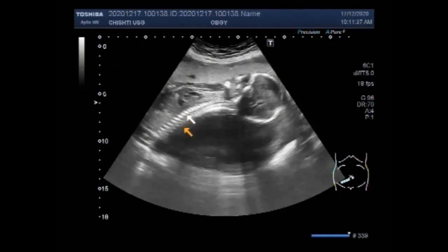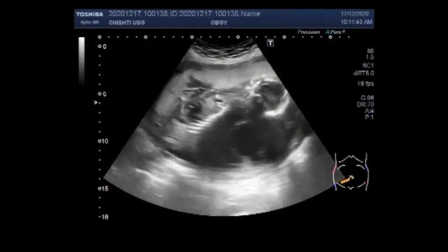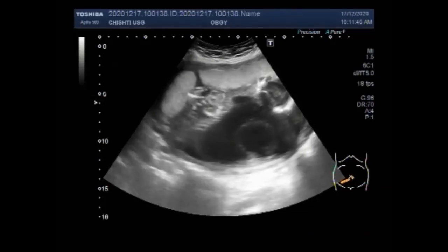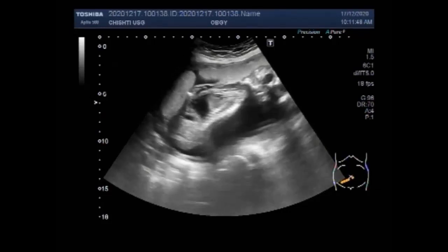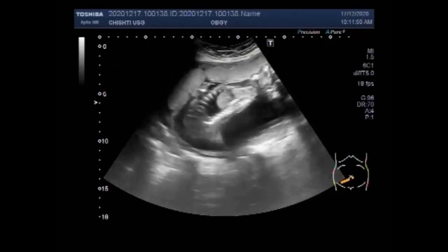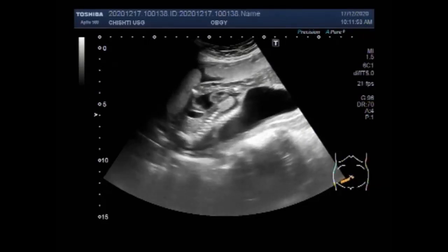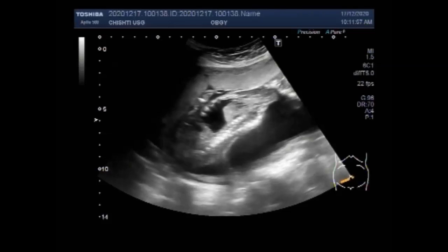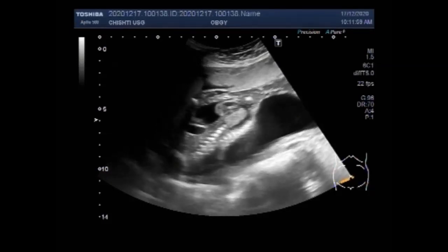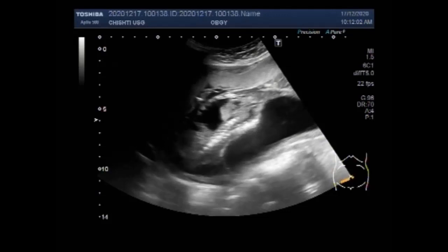These are the spines. Now again you can see the encephalocele is also visible. Although the fetal cardiac activity is present, but there is no fetal movements. You can see the fetal cardiac activity.